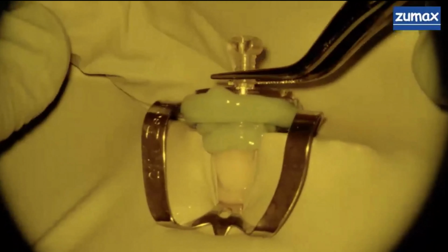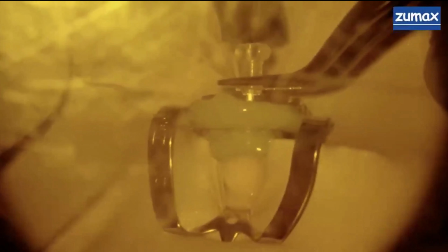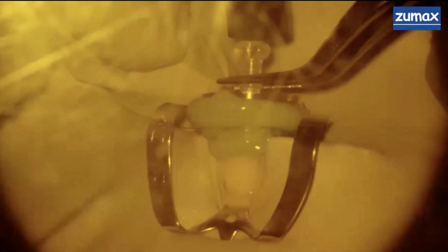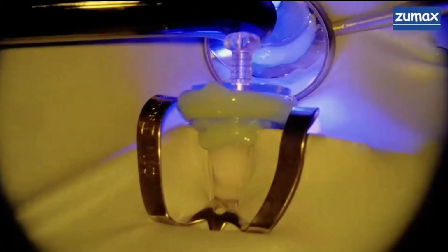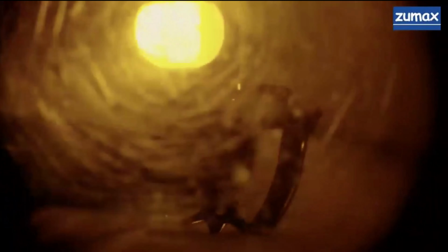It does. So now the material is on, I seed it, and then I polymerize. You really want to make sure you also polymerize well in the lingual aspect here so that it's not soft. I can do some indirect curing. You can angle your mirror towards the lingual and cure in your mirror.